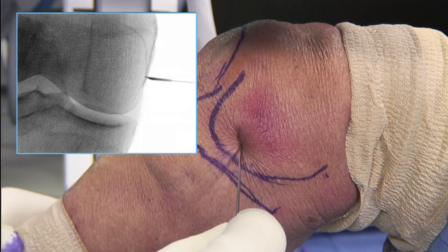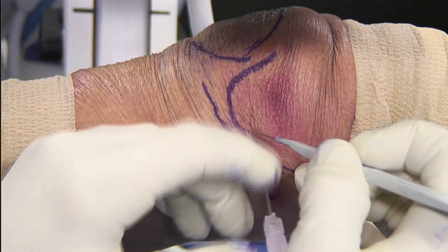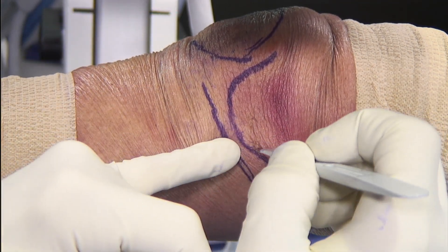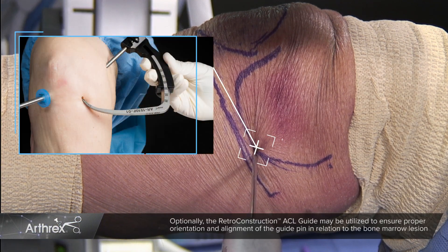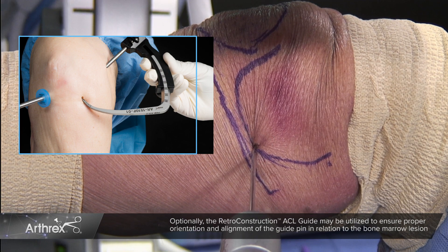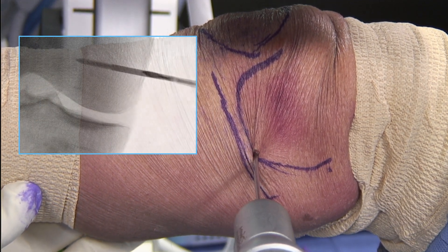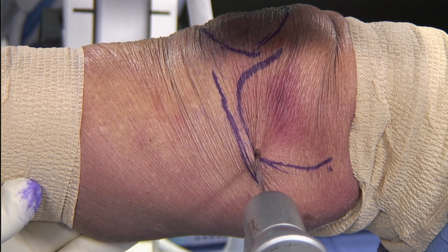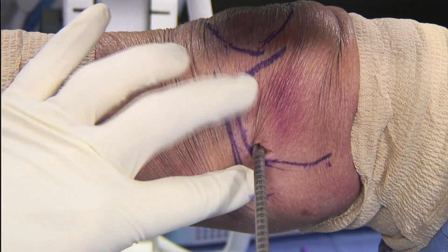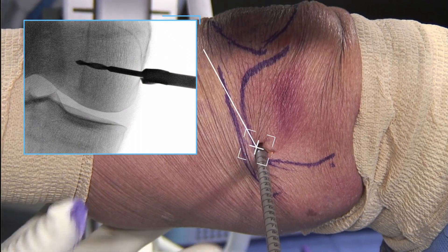Once I have this targeted, I put the spinal needle into position. I'll make a small percutaneous stab incision with an 11 blade. I have now correlated my 2.4 guide pin with the spinal needle used previously. I then target the lesion by drilling across the condyle. It's important to have enough guide pin in position so that we don't lose our position as we begin our core decompression. The 7mm cannula reamer is then passed over the guide wire and the core decompression proceeds.